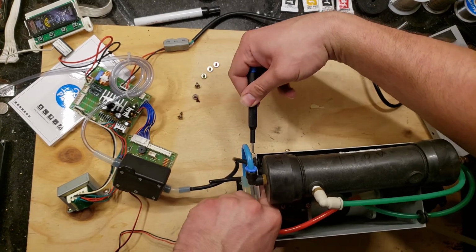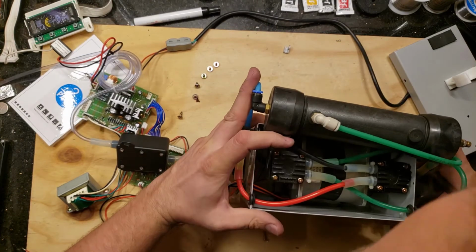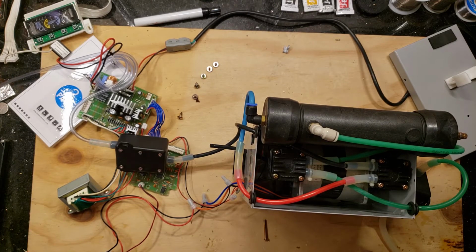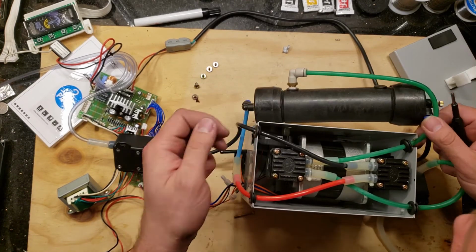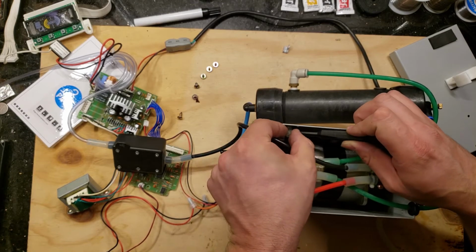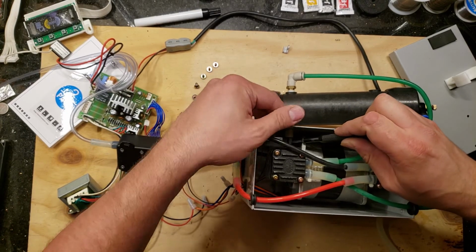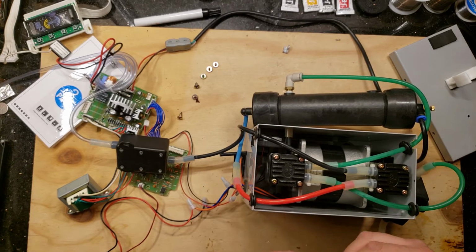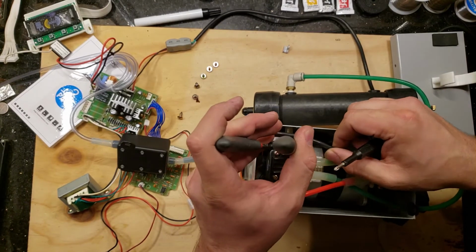I'm going to try and tighten the other one. Let's see, yeah, something is making noises in there. Oh, we've got another bolt. I wonder what that used to attach to. Oops, oh, it looks like it's this one that decided to jump back out. So let's fix this real quick. And let's put it back together. Well, this unit back together, not the whole thing, because I don't plan to use their control board.